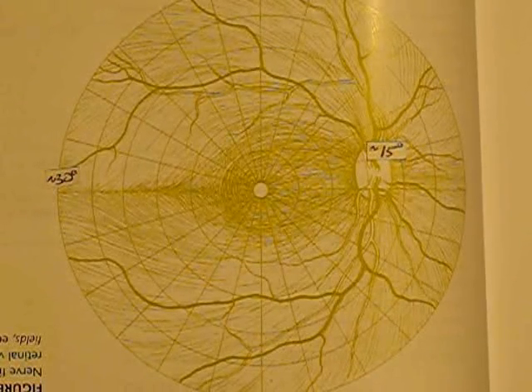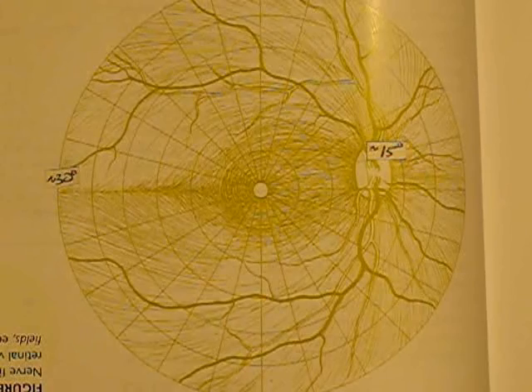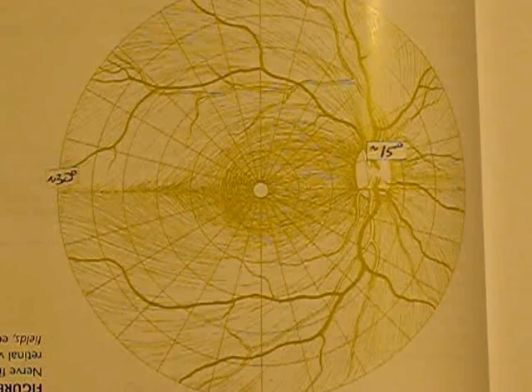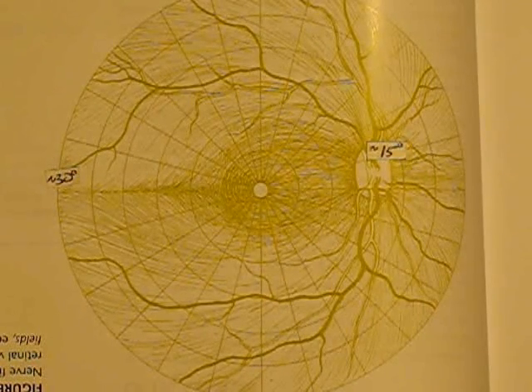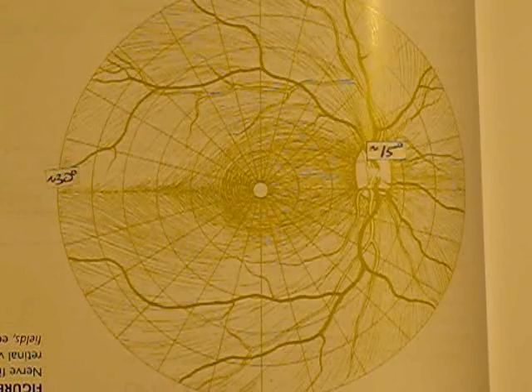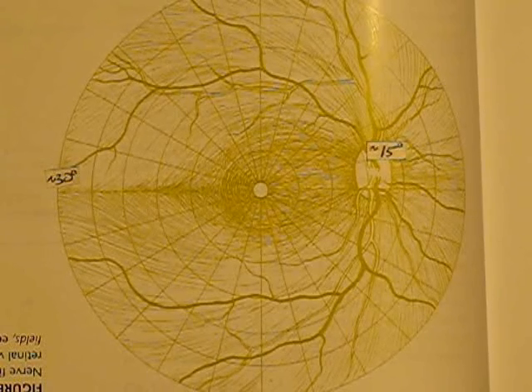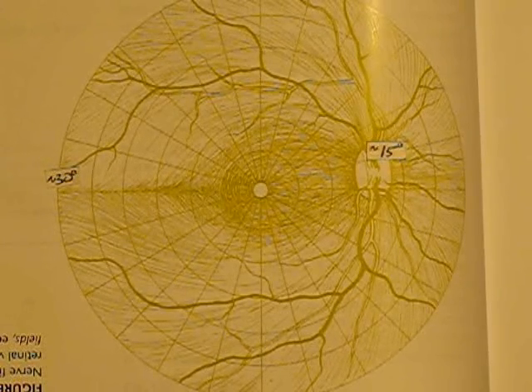The point I was making is, can we predict the area of rim thinning on an optic nerve based on the location of a visual field defect, or vice versa? Can we predict the location of a visual field defect based on where the rim is thinning?